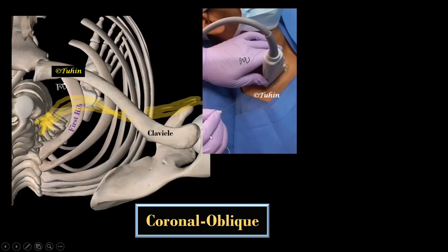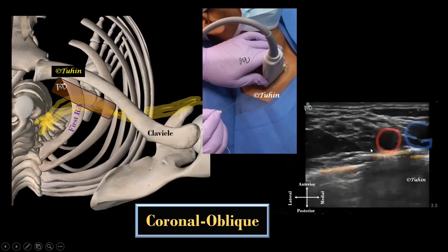Let's understand the difference between the two techniques. In the conventional or coronal oblique technique, the probe is placed immediately cranial or posterior to the clavicle. Here we are getting a transverse sectional view of the subclavian artery and the brachial plexus, and only a short segment of the rib — because the rib is not anatomically straight. Hence, the pleura is exposed here and here, as you can see on the ultrasound image.